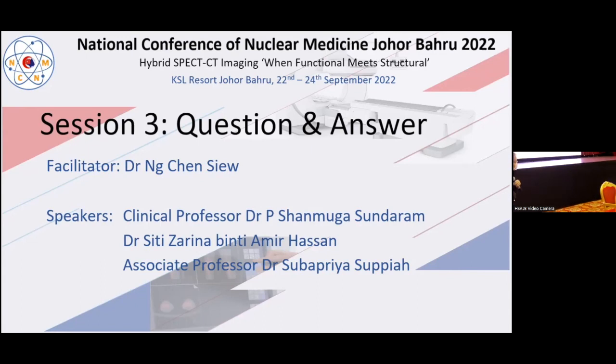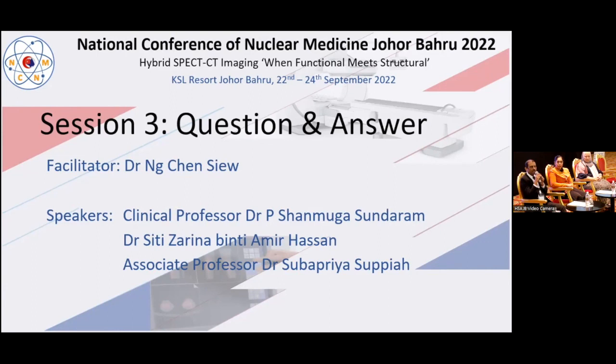For that matter, even in India, majority of the centers or more than half of the centers may be doing the same procedure what you explained, mainly to avoid the second visit of the patient for a pure subtraction study. But I don't agree with that. I will substantiate why I believe a dual phase study is much more relevant. The sensitivity of dual phase parathyroid scan is more than 80% in adenoma. So the most important criteria to identify the presence of an adenoma is the delayed scan.